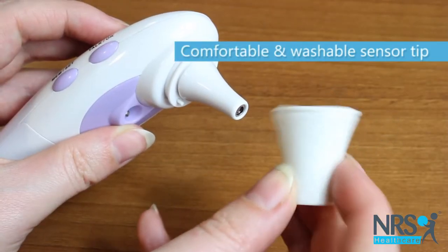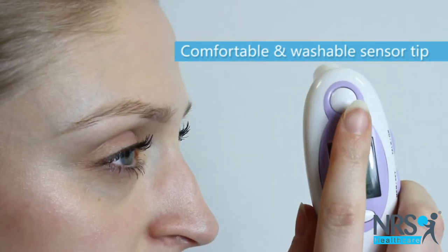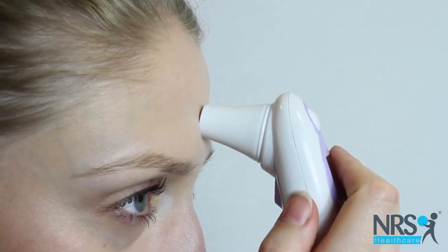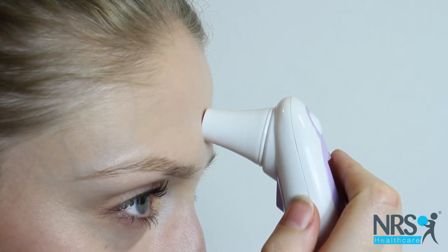To take the temperature on the forehead, add the washable sensor tip and hold firmly in the centre of the forehead. Press the button to take a temperature reading. Your body temperature is 36.8 degrees Celsius.